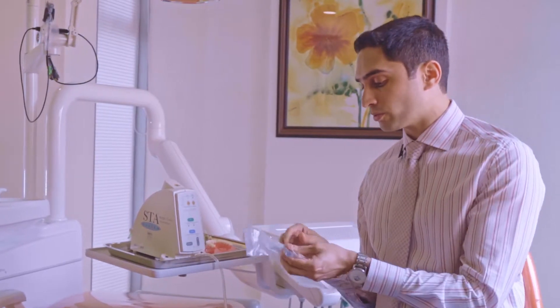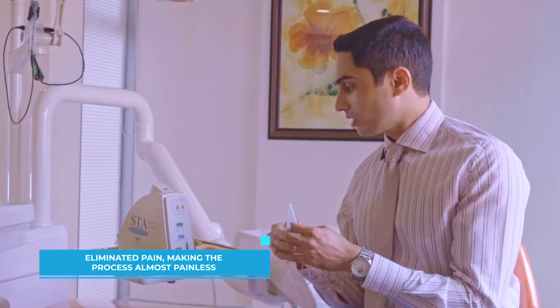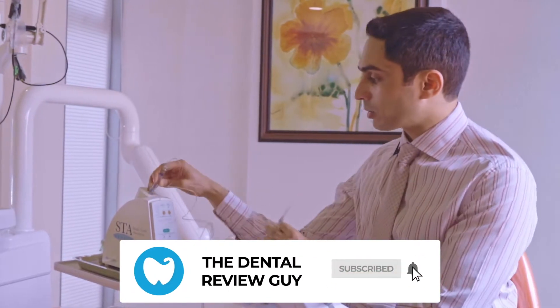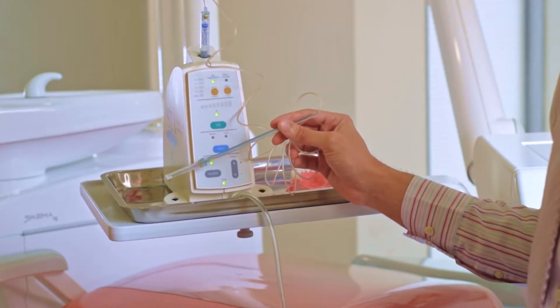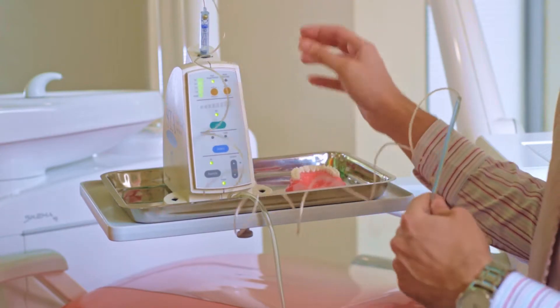This has almost completely eliminated all of the pain. I'll show you how it works. We take a local anesthetic cartridge, put it into the plunger, mount it on the system, and it gives you audible cues telling you that it's ready to go.